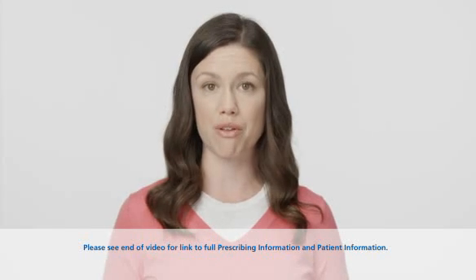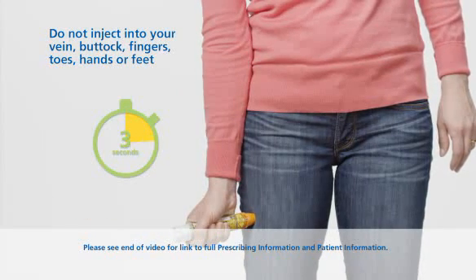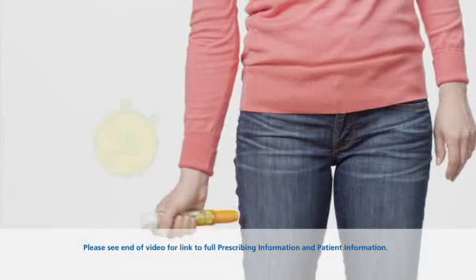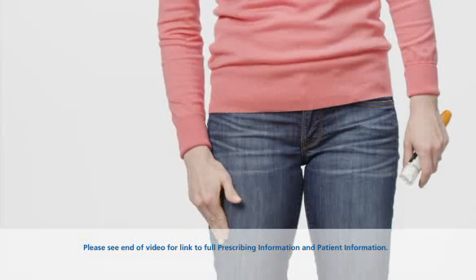To inject, hold the orange tip near your outer thigh. Then swing and firmly push against your outer thigh at a 90-degree angle until you hear the EpiPen click. The EpiPen is made to work through clothing. Continue to hold the EpiPen firmly against your thigh for approximately 10 seconds to deliver the medicine. Now that the injection is complete, remove the EpiPen and massage the injection site for 10 seconds.